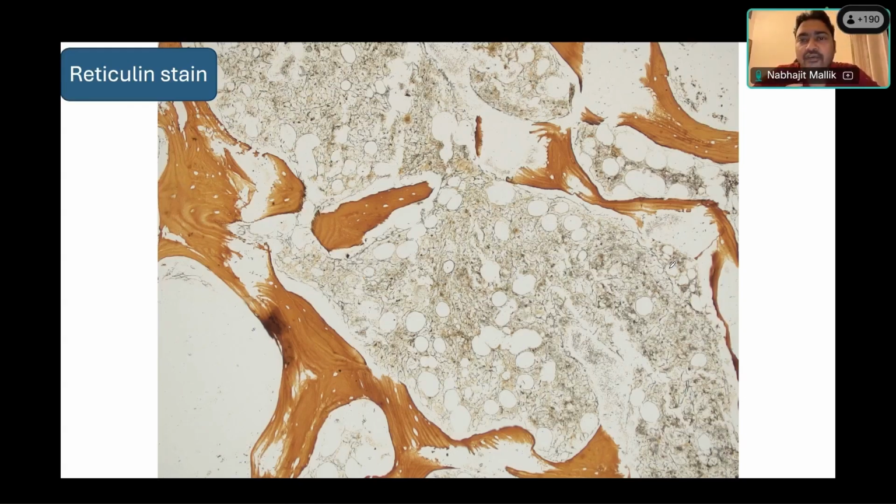So first thing, of course, will be to rule out a CML. Do you think this looks like a CML, chronic myeloid leukemia? No, sir. Why? Because in CML, all the progenitor cells of the myeloid series will be increased. Great, in the PBF. Wonderful. So in the PBF we could not see the large number of myelocytes and metamyelocytes that we usually see in a CML case, right?